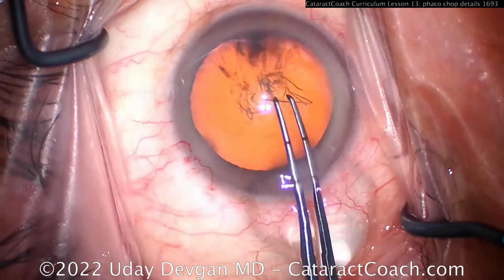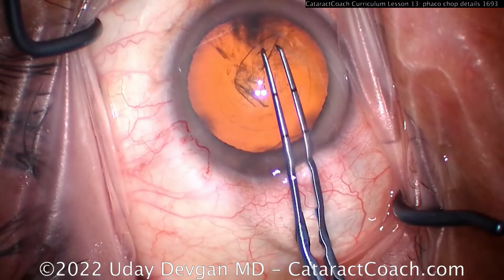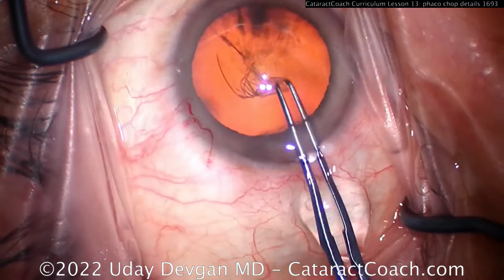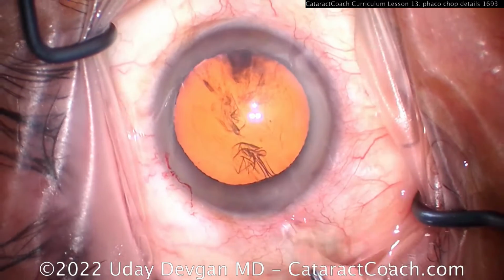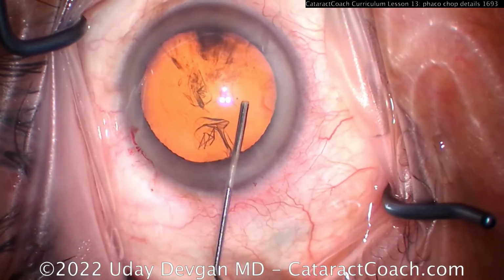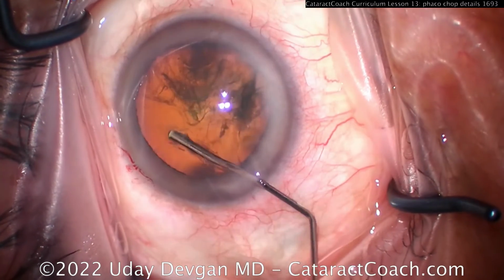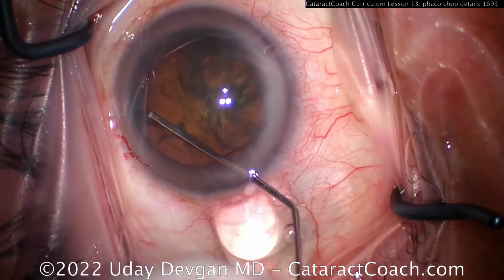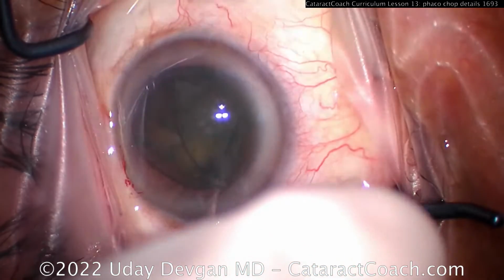Now, the first thing to keep in mind in any kind of fluidic settings is, what's the tubing size? Meaning, if I was going to drink a milkshake through a very skinny little cocktail straw, I need really high vacuum and I'll get really low flow, right? But if I use a very large bore straw, I could use a much lower vacuum and get much higher flow. So all the fluidic settings they'll tell you about don't make a lot of sense unless you're using the exact same Phaco tip I'm using.